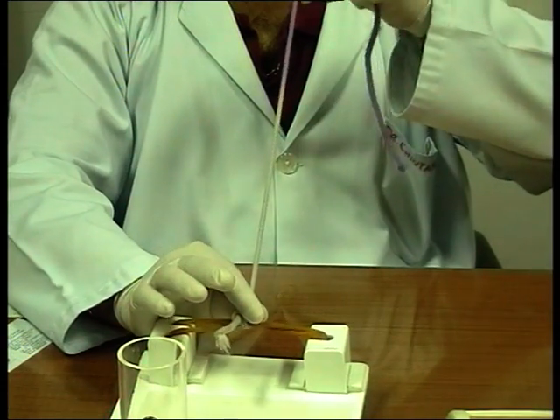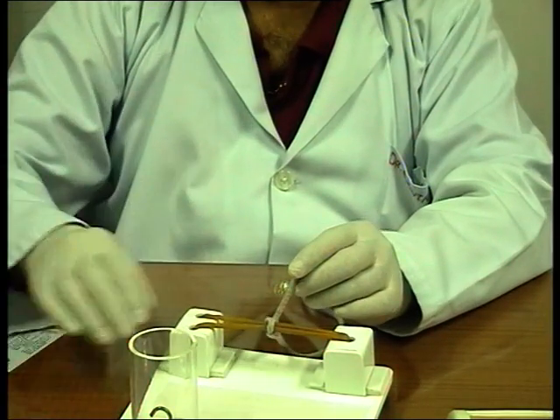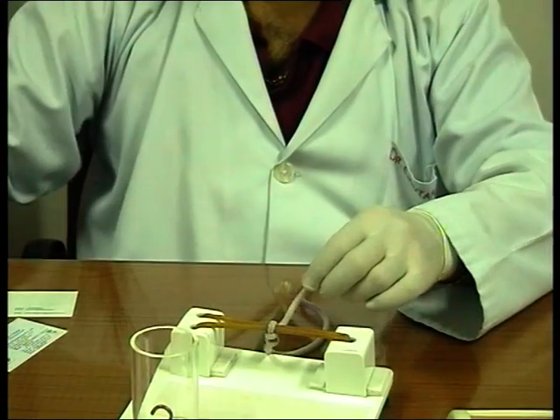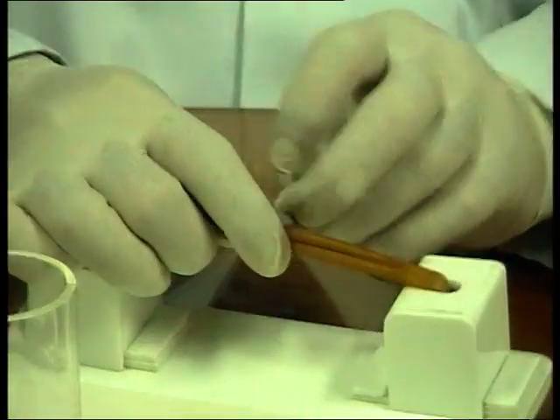Slip knot is also used in laparoscopic surgery when we prepare a knot for appendix. You just slide it down the base till the base. Suppose this is appendix, knot goes down. If this is holding it, and I want to slip it down, I'll just show you that. Or here.